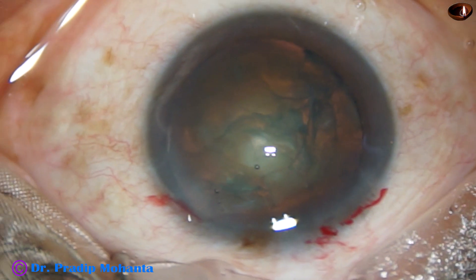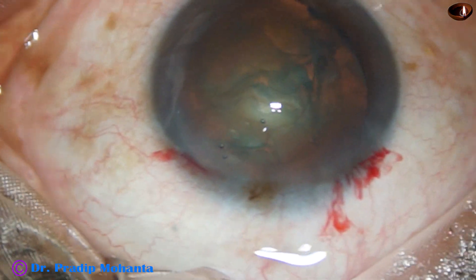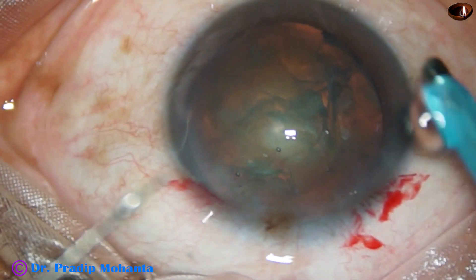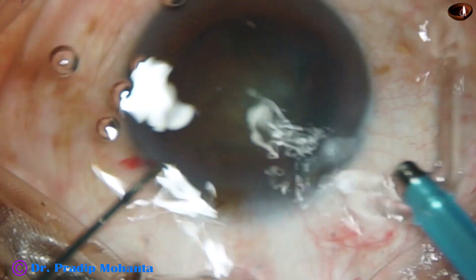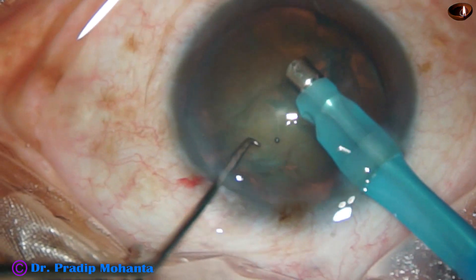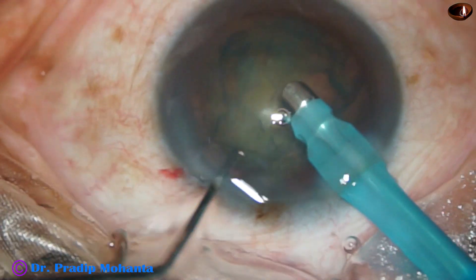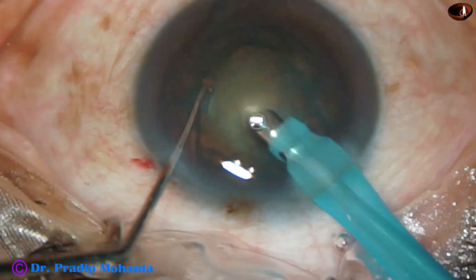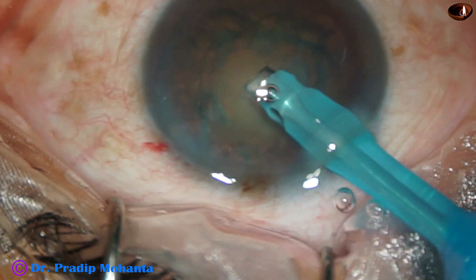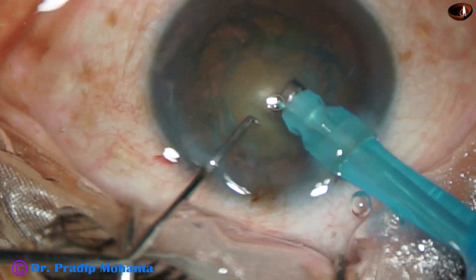Now the tip of the phaco needle is introduced. The exposed part of the tip is not much because this is a soft cataract. Nucleus sclerosis in this case is about grade 2+ or maybe grade 3 — it is a pretty routine case. The nucleus rotates very nicely. Now I turn the handpiece and make the bevel up. The bevel of the tip of the phaco needle is made up now.